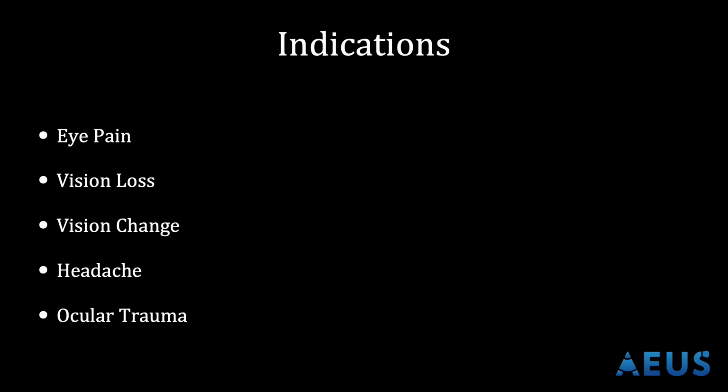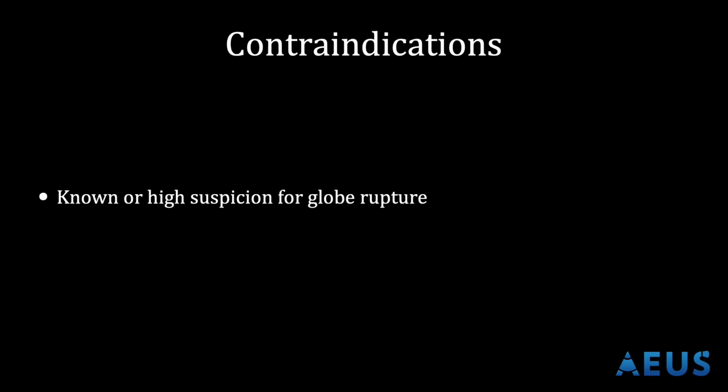There are many indications for ocular ultrasound, including eye pain, vision loss, or vision change, headache, or ocular trauma. The only contraindication to ocular ultrasound is a known or suspected globe rupture, as placing pressure on the eye for the ultrasound can cause additional damage.